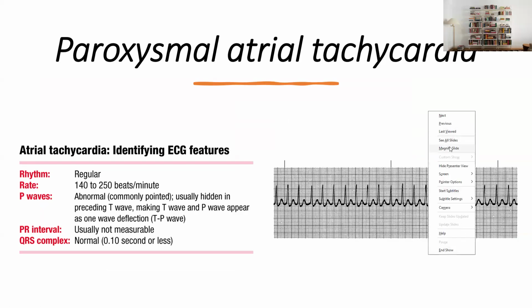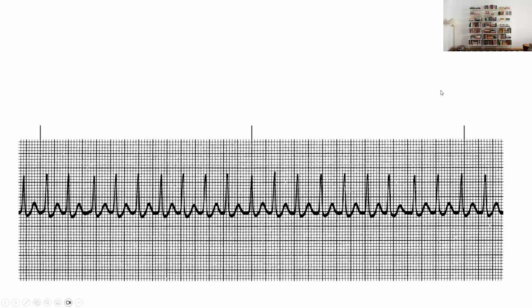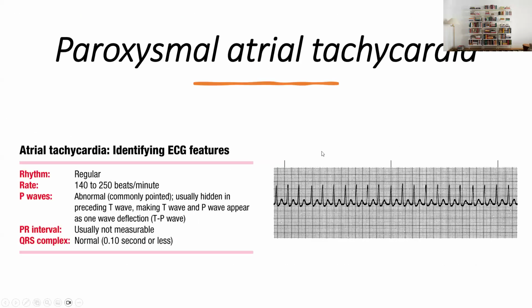So if you take a look at this particular slide, what do we see over here? A rapid heart rate, very, very fast. So I think we counted this earlier and it was 190. Yes, 190. And obviously, nobody can tolerate a heart rate of 190.